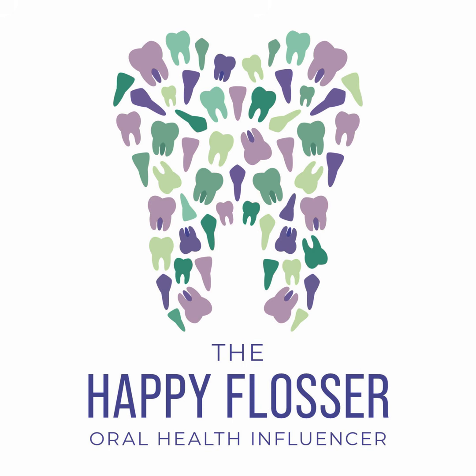Some of the terminology associated with radiopaque lesions includes things like focal opacity, target lesion, multifocal, confluent, irregular or ill-defined. Ground glass is another appearance. It looks like a lesion with a bunch of ground glass in it, or soft tissue opacity. So those are some of the appearances.